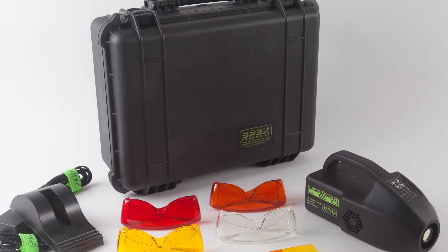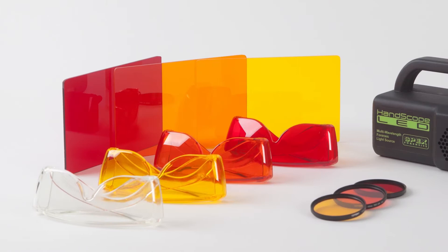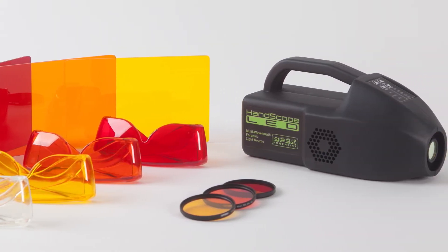At 40 watts per wavelength and weighing under three pounds with its battery, the HandScope LED is very light to manage and easy to transport with all its included accessories.